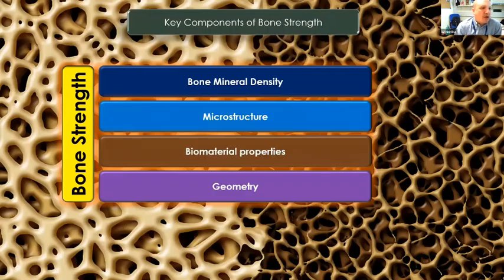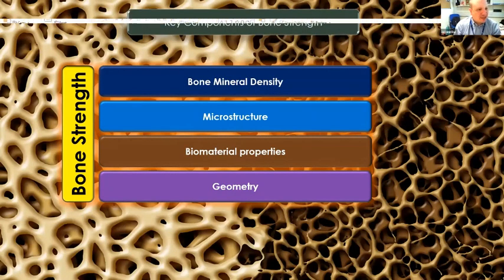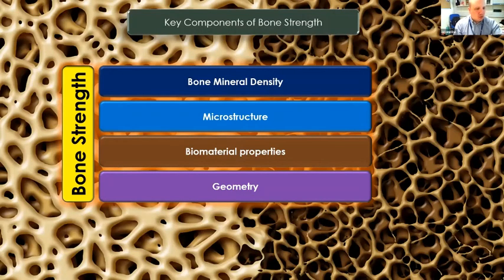That's obviously one component, but then you also have the microstructure of the bone, which can be assessed using trabecular bone score on DEXA scans, but most DEXA scan machines are not activated for the trabecular bone score. And that basically takes a zoomed in picture of one of your trabecular areas and sees how similar to a chessboard it is, essentially. So a chessboard is meant to be the whites and the blacks laid out in a very strong way. And if it's very irregular, that's a poorer textural score, which means worse microstructure. Diabetics, for example, have quite poor microstructure.